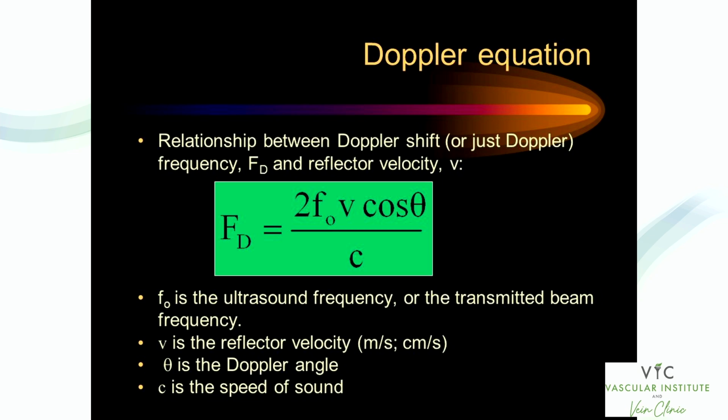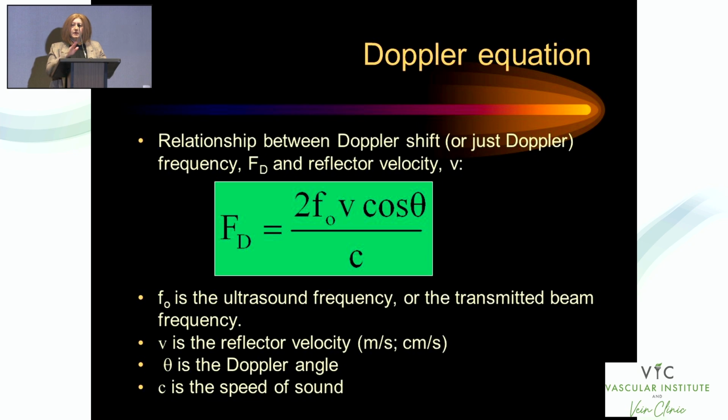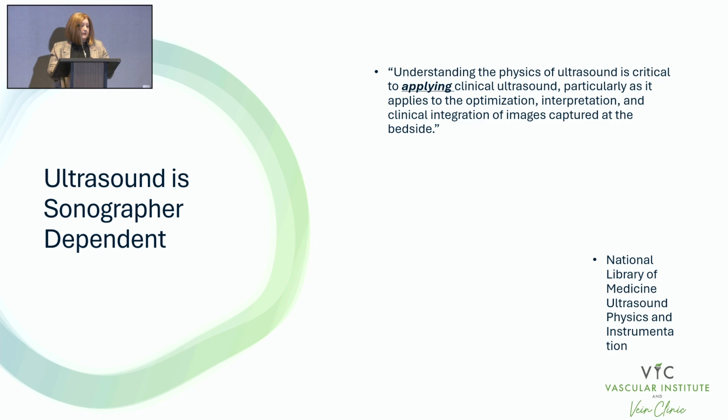Well, I threw this in there, and I know all you sonographers know this forwards and backwards. This is the Doppler equation, and this is what rules our world, right? But I put that in there because ultrasound is sonographer dependent.